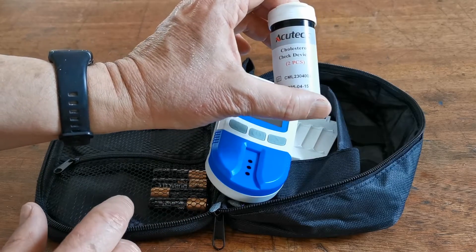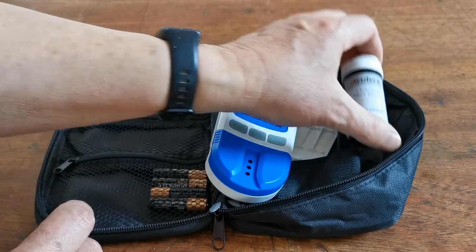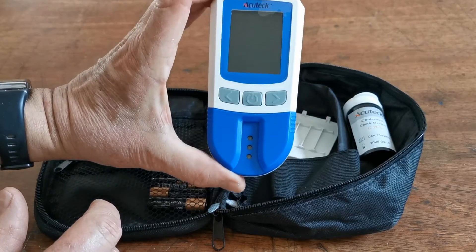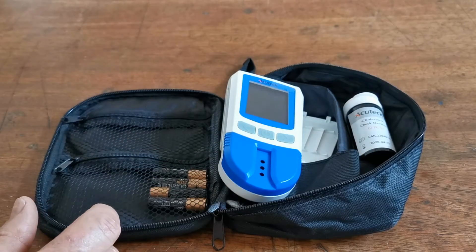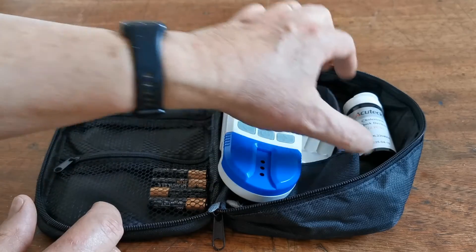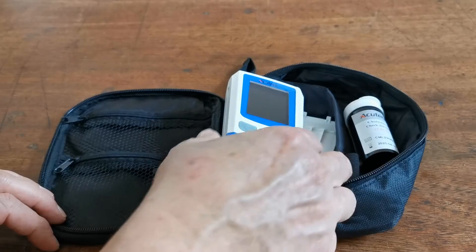These cholesterol check devices don't have to be used initially on setup, but they can be used at any time up to the expiry date shown on them to check the optical function of the digital meter. They can be used multiple times, but must be used within 12 months of the seal being broken. Do not open these until you require to do a test.